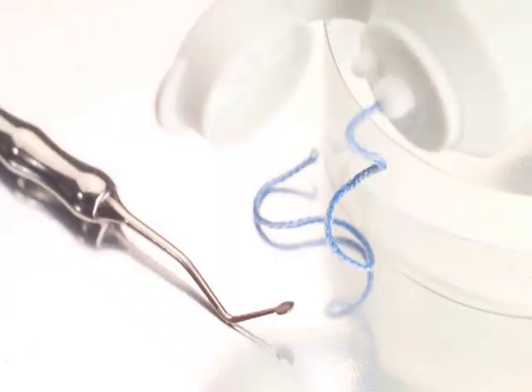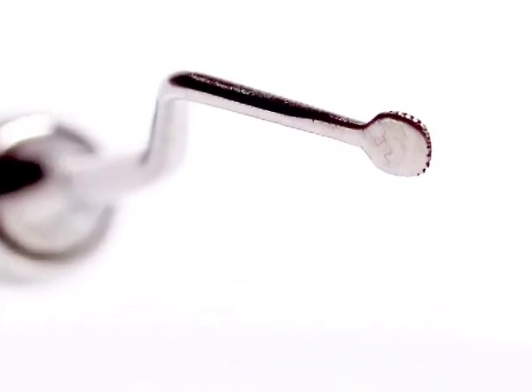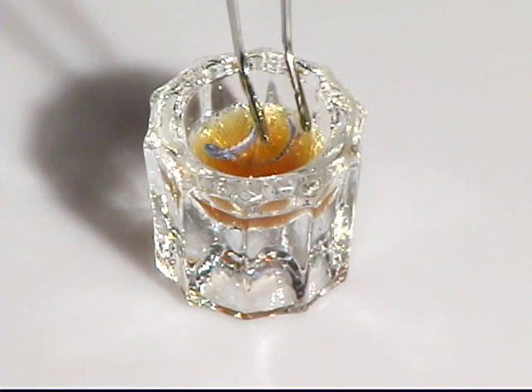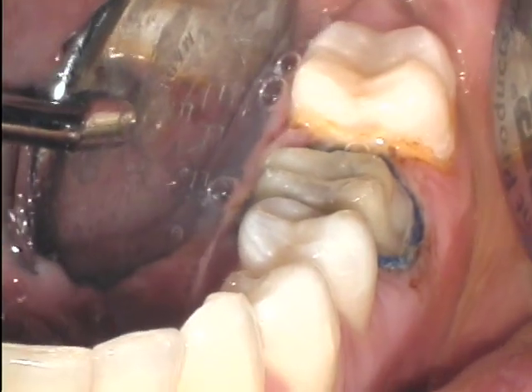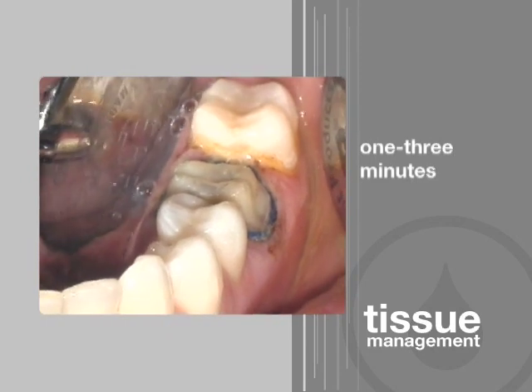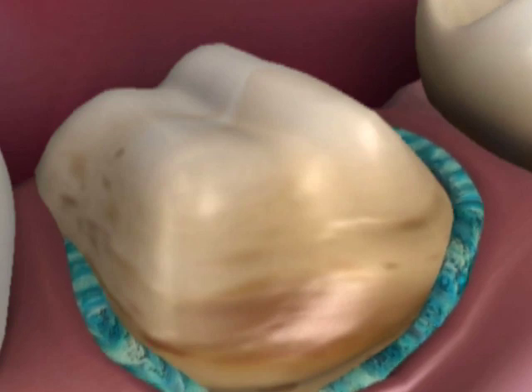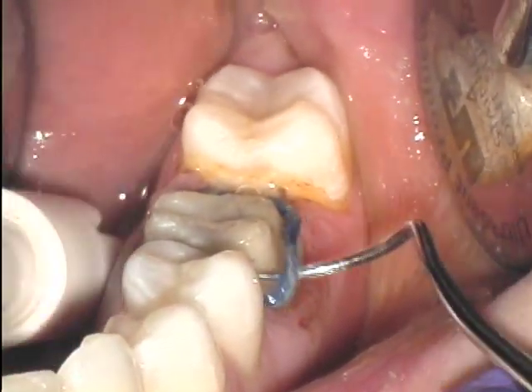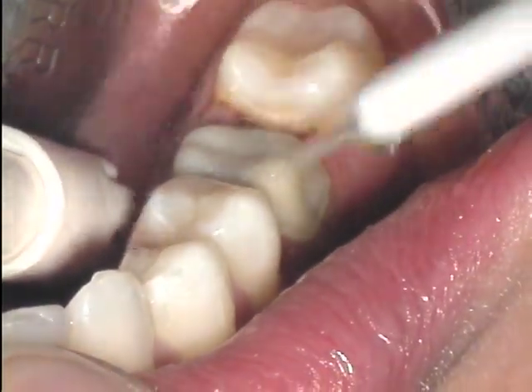In general, knitted cords are most easily placed with a thin packing instrument. Ultradent offers serrated packers and the large and small slide packers. An Ultra-Pak knitted cord is soaked in Viscostat and then packed into place. After packing, rinse the area. The cords need to be left in place for only one to three minutes, rather than the customary 10 to 15 with other materials. Retraction is rapid because hemostasis has already been achieved — no blood is present to dilute the retraction agent in the cord. Remove the cord and once again, clean the area and test for completeness of hemostasis with a firm air-water spray before the impression material is mixed.